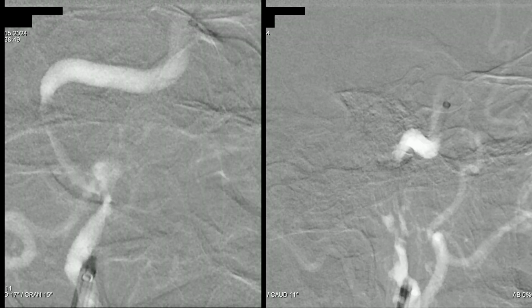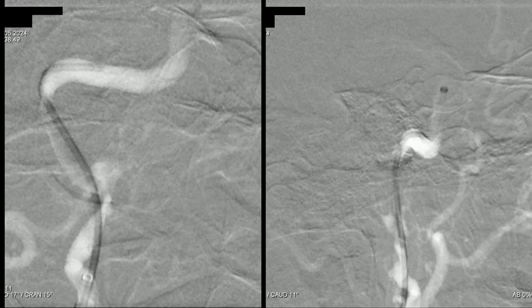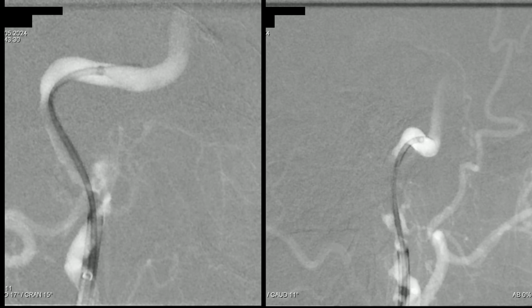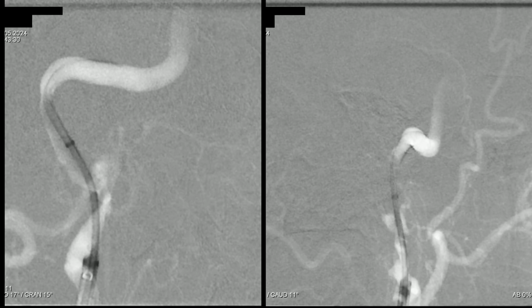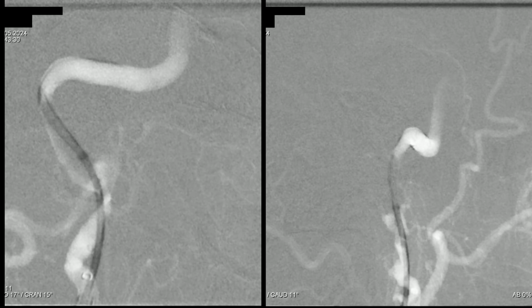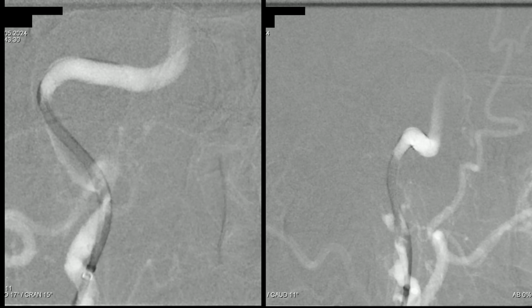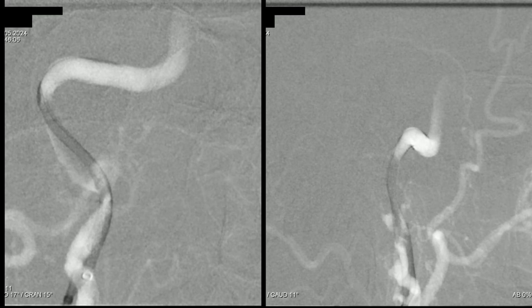And now we can push the Carotid stent through the Neuroslider 52 to the distal parts of the ICA and start the implantation. And as you can see, the Carotid stent implantation is very similar to flow diverter implantation, and we continue unsheathing the Carotid stent. And for the proximal segments of the stent, we don't need a roadmap.